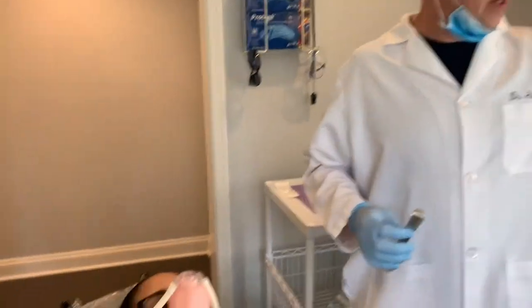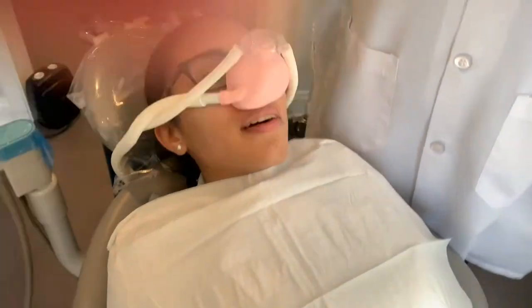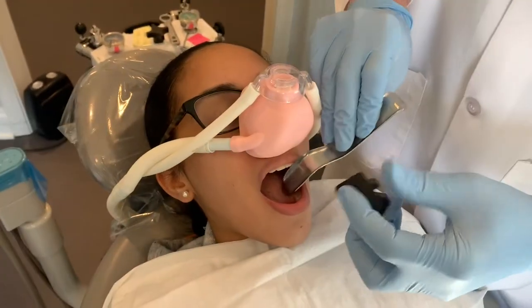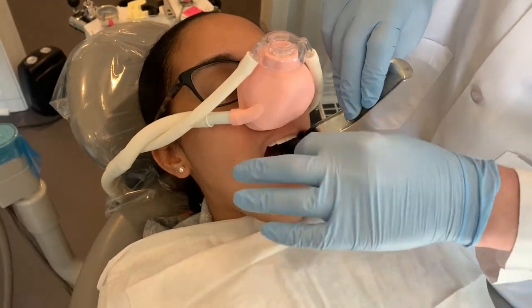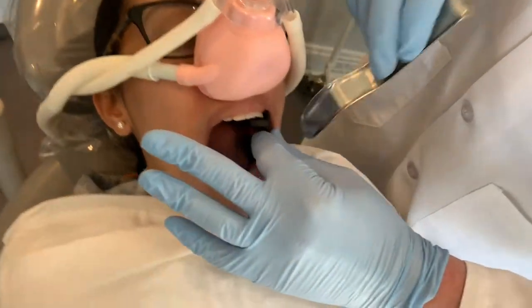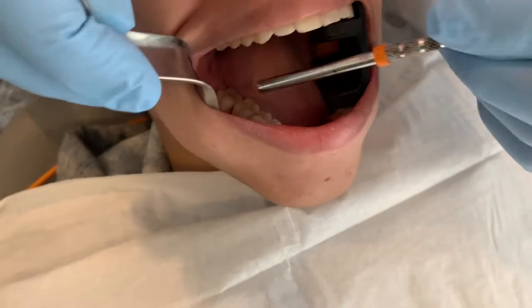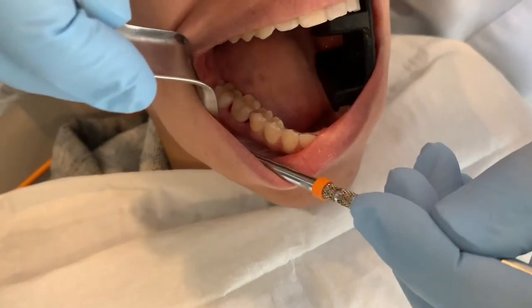Like I said before, step one is to cut the tooth into two pieces. Let me see that bite block. I will typically give the patient something to rest their teeth on. Is that okay? Mm-hmm. Okay. And open big. Good. And just to orient everybody, this tooth right here is tooth number 30.